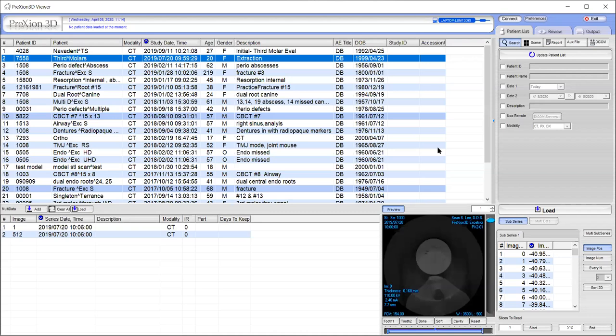So the first thing you'll want to do is launch your Prexion 3D Viewer software and once logged in you'll want to find your patient's file under your patient list. In this example I'm going to be using the second file listed under the name third molars.